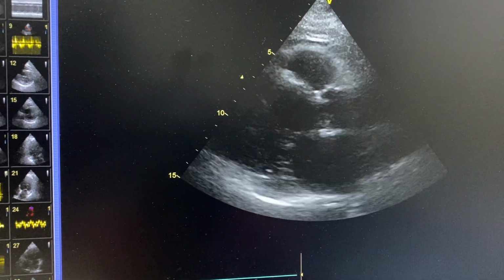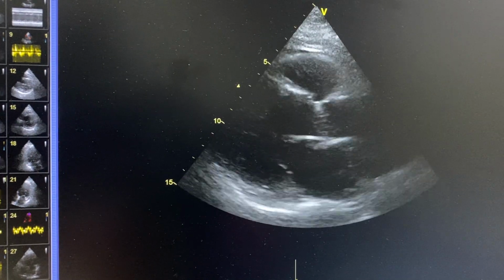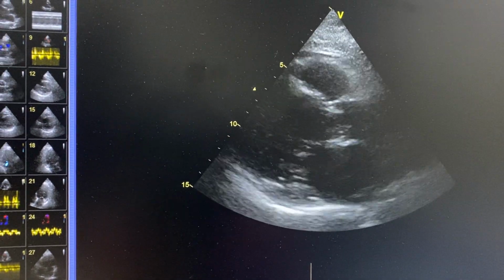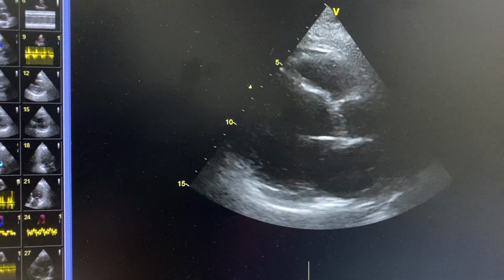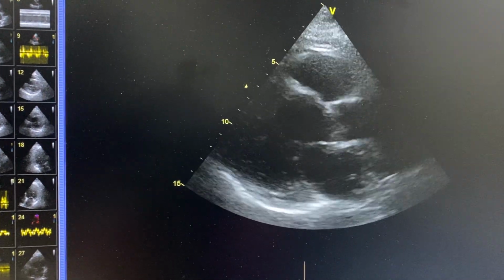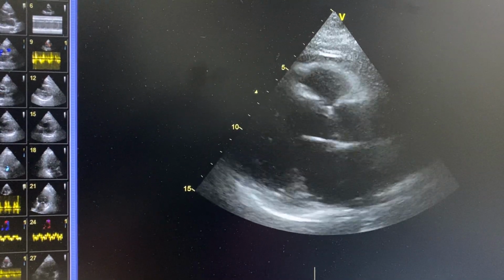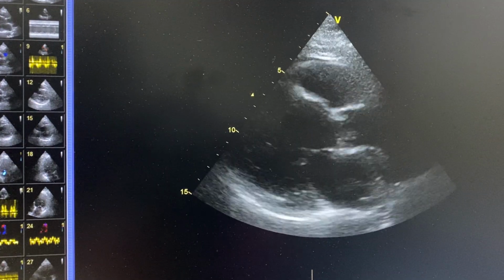Good evening, everyone. As we've been doing, we have been handling LV segmentation, of which the most important thing is to quantify LV function, either systolic or diastolic, depending on the regional wall motion abnormality of the left ventricle.